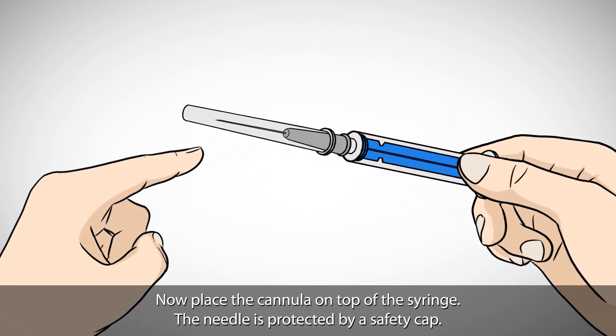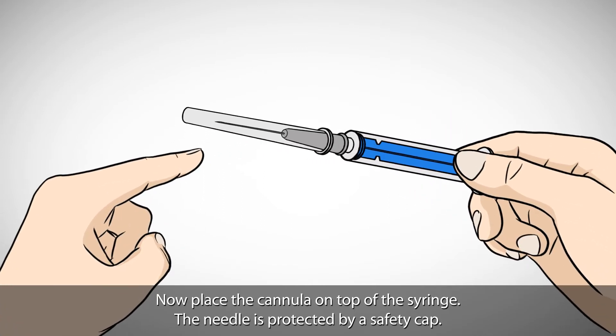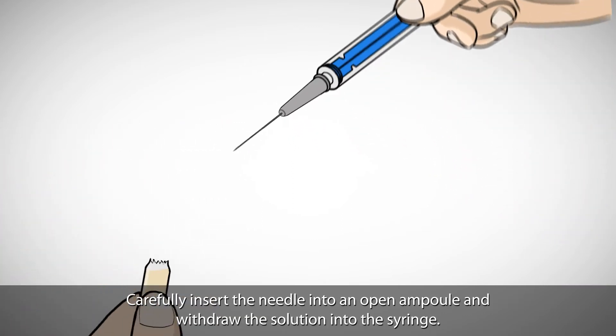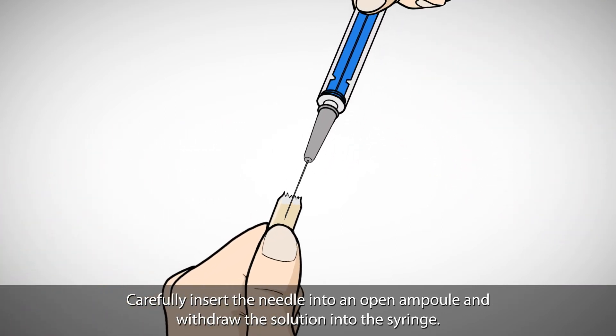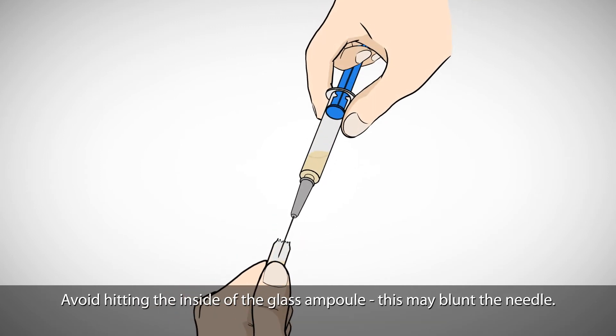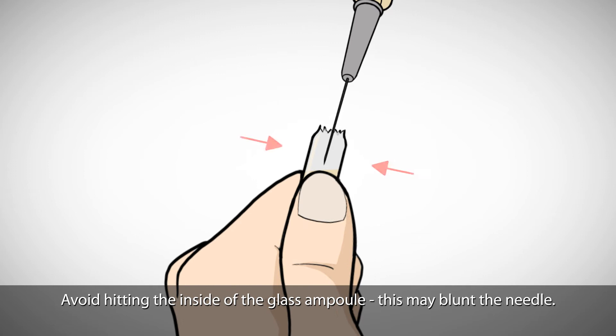The needle is protected by a safety cap. Remove the cap off the needle in order to fill the syringe. Carefully insert the needle into an open ampoule and withdraw the solution into the syringe. Avoid hitting the inside of the glass ampoule, as this may blunt the needle.